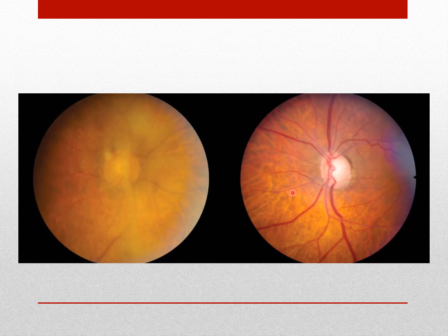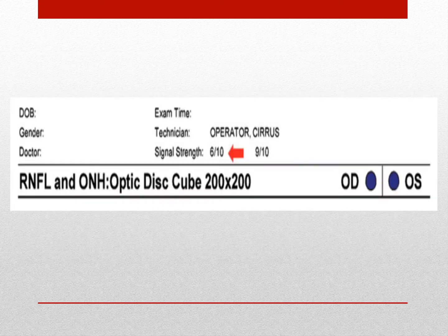Looking at the left eye, clearly you can see a perfect clear image, but looking at the optic nerve, I'm getting the glaucoma vibes just looking at this, right? So look at that optic cup, it's pretty big. Follow the blood vessels, you can see the depth of it. We're going to take a scan and see what exactly is going on here.